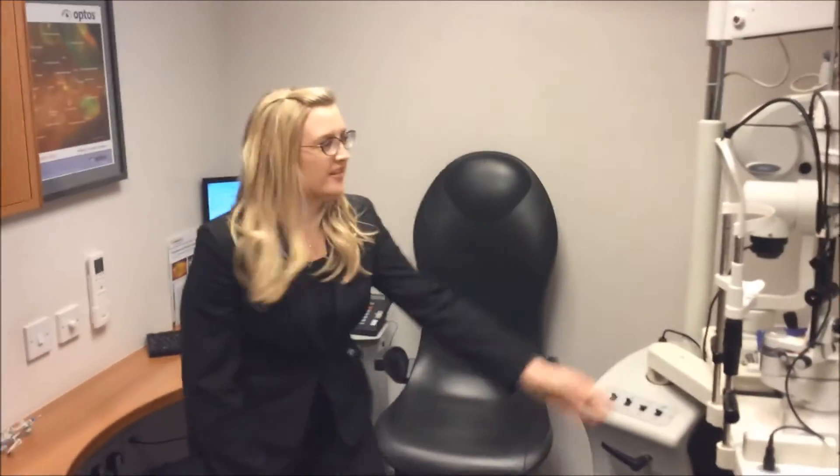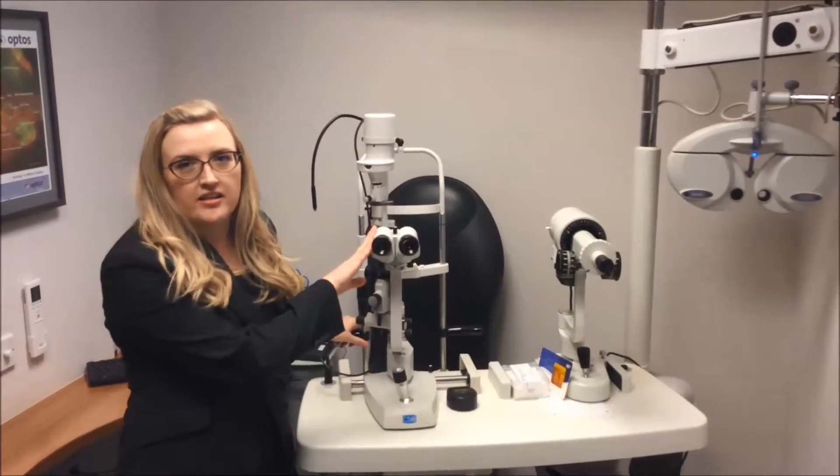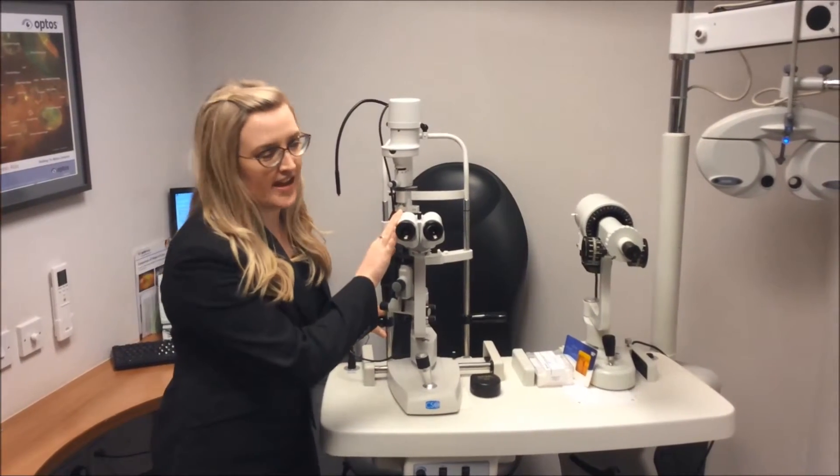So this machine here is what we call a slit lamp. This is used to check the health of both the inside and outside of the eye.